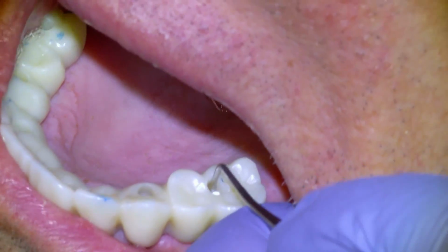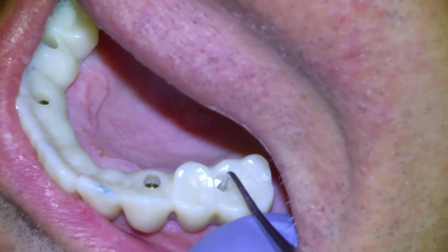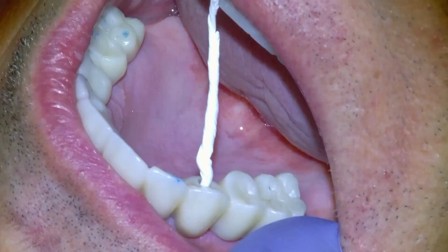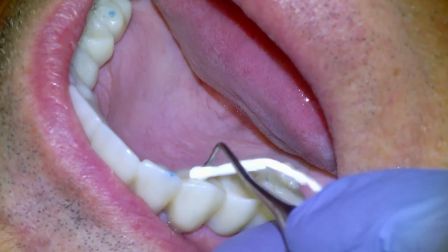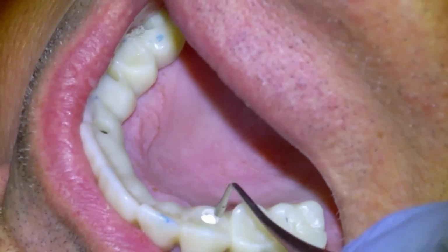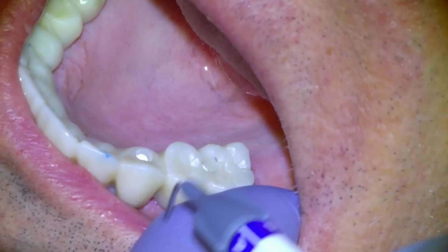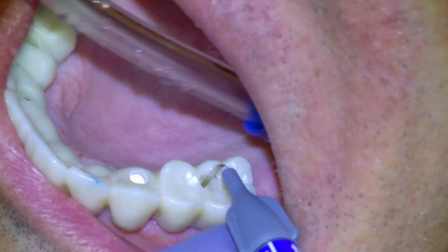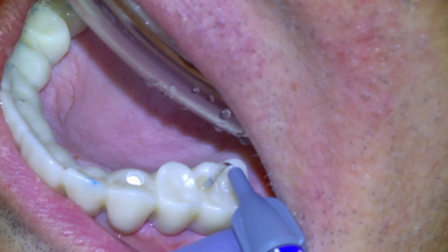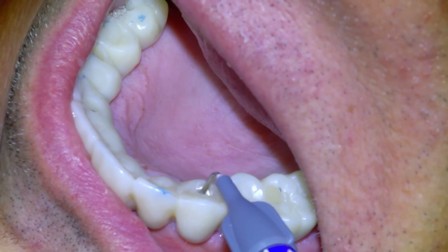So we'll pack our Teflon tape into the screw hole and leave 3 to 5 millimeters of space to fill in with a standard dental composite filling material. We're gonna pack the second screw hole here, and then you'll see me injecting in a flowable dental composite to fill up the screw hole the rest of the way. We'll overfill it a little bit, and then we'll trim it back after.